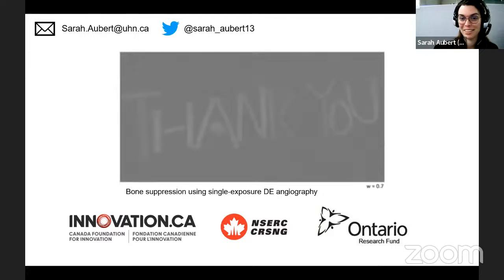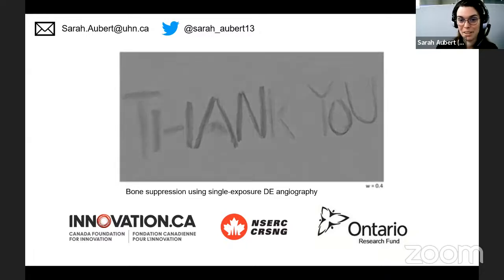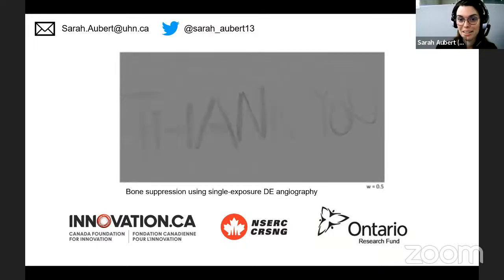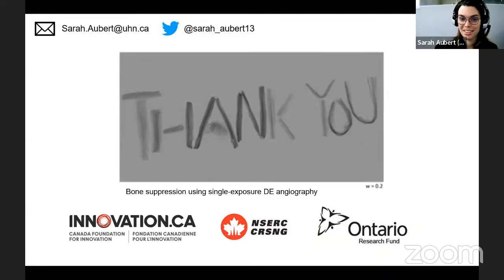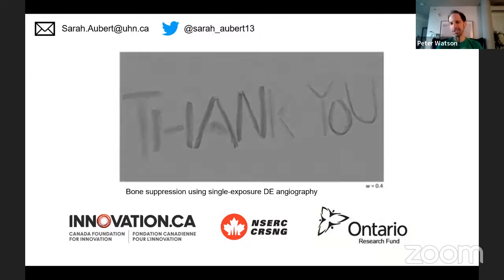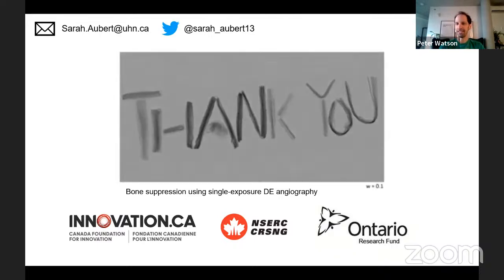There will be some kind of thing that exists, but so far the excitement is around photon counting CT, which is great. And once that picks up a little more speed, you could see a flat panel fluoroscopy implementation. Right. Because you have one in your lab. Yep. It's very small, but the proof of concept is there. It just has to be developed into a radiography-sized one.